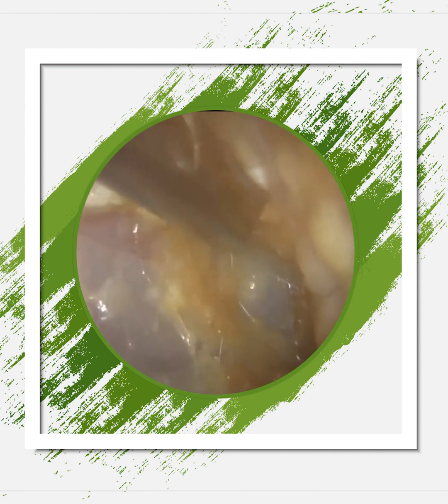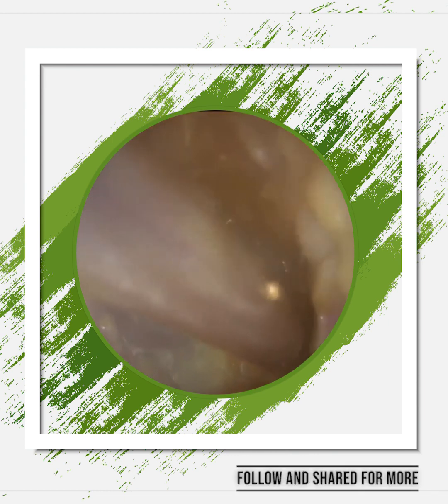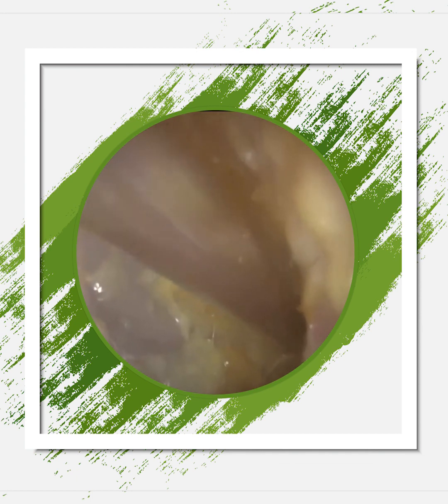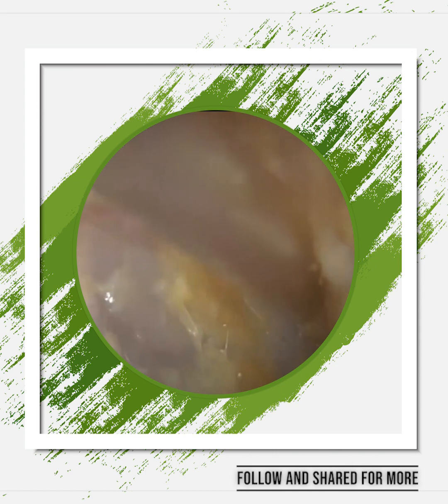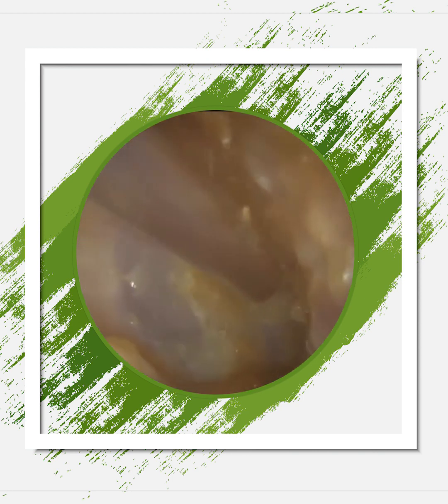So the wax here is very wet and soggy. The patient has been using loads of drops. They have been admittedly using the shower head, and I've removed the majority of this wax. There's a bit of damp staining here. We can see it right in against the eardrum here. We're on the anterior recess, and we're just going to be careful. We don't want to traumatize the side of the ear canal or perforate the patient's eardrum.